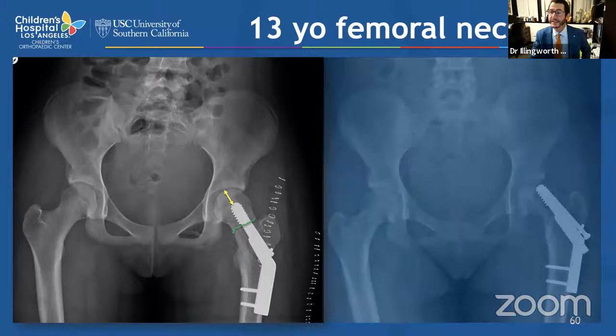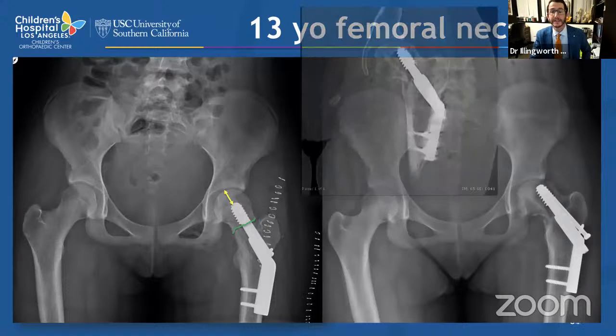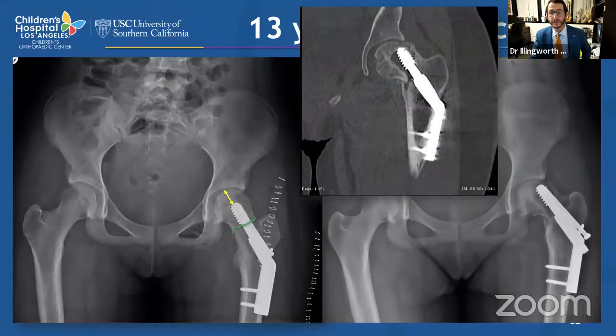So here's 6 months after that particular fixation. Again, we can all appreciate varus collapse. There's a partial union, but certainly there's a non-union along the medial calcar. And when we look at the CT scan, we can see the screws are cutting out proximally. There's some healing along the proximal femoral neck, but certainly some non-union along the medial calcar and medial femoral neck.